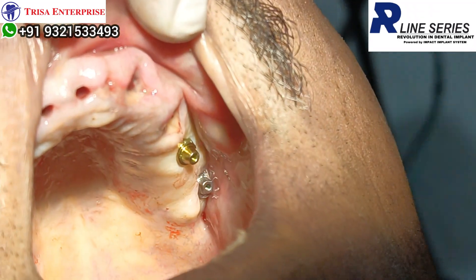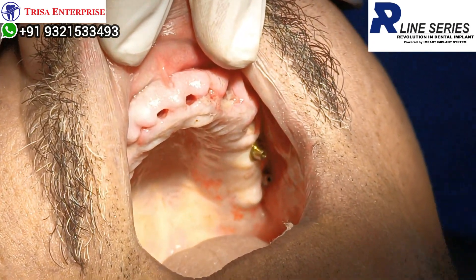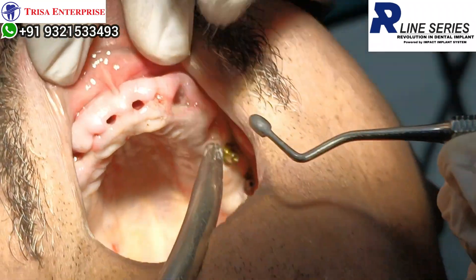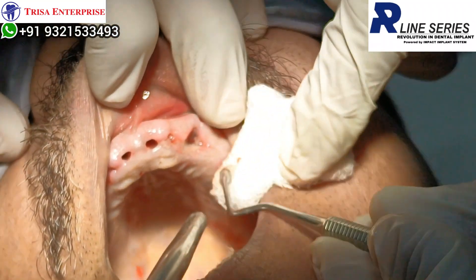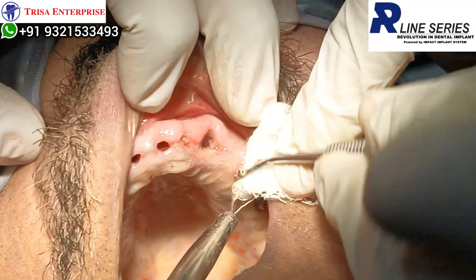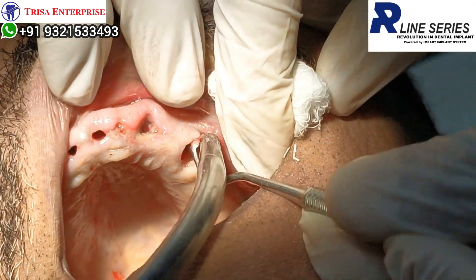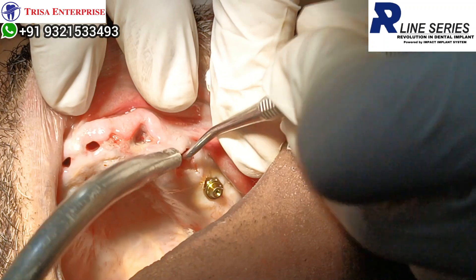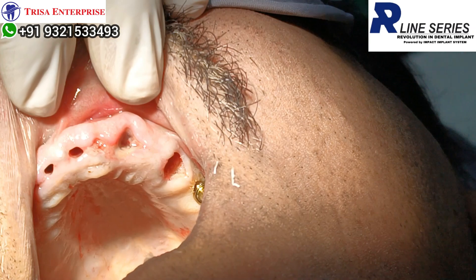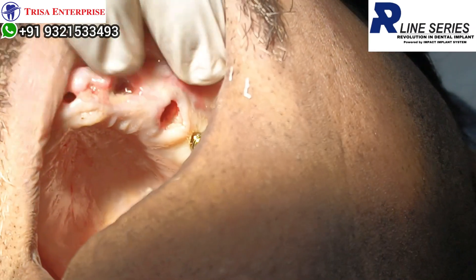Now I am going into the extraction zone. In the extraction zone, always curete it. This is the extraction site of the second pre-molar — just counter-check on the OPG. You curete all the infection which is there. You don't want to place an implant in any residual infection, so with Betadine you curete the zone very nicely. I also have to be cautious because I am going to be close to the lining of the sinus. I will go slow.